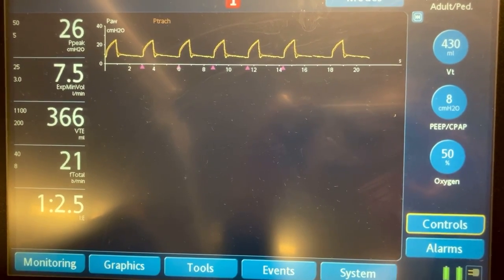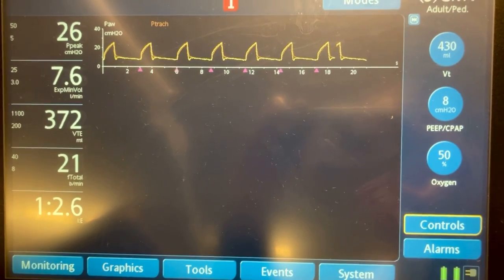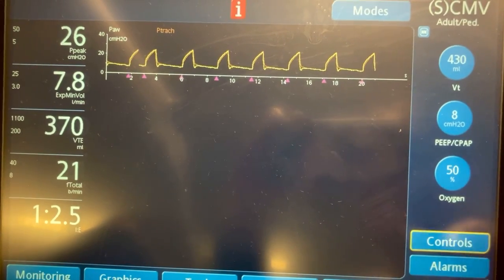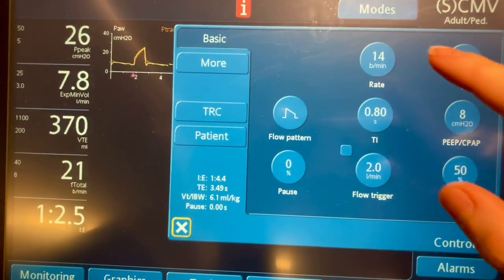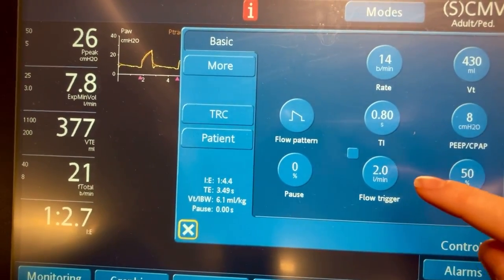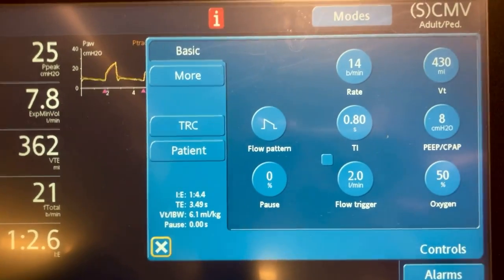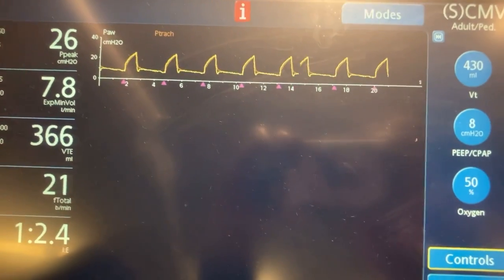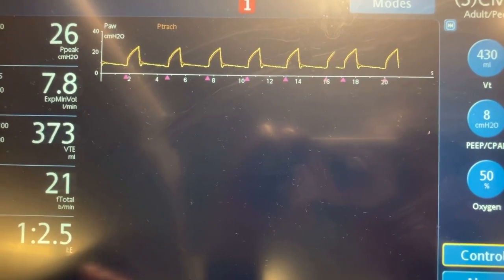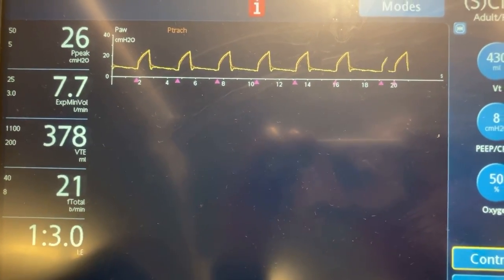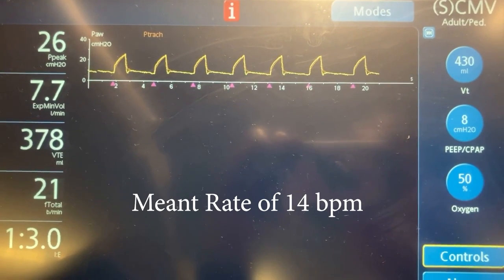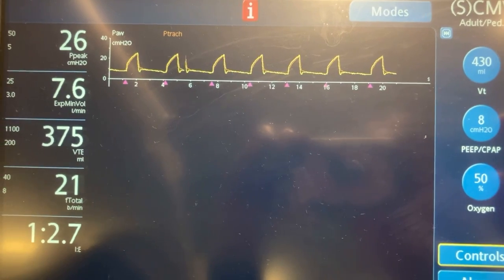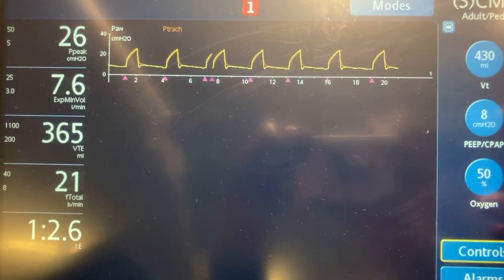This is in the room of a patient who has had formal brain death testing. When I go to the controls, I've set the rate to 14 and their flow trigger is on 2. Yet when we look at the vent, you can see that they're breathing 21 times a minute, despite being on a rate of 15.